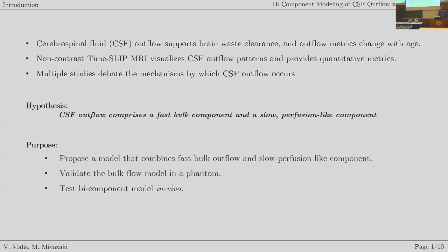So CSF outflow supports brain waste clearance, and outflow metrics change with age. A non-contrast time-SLIP MRI visualizes CSF outflow patterns and provides quantitative metrics. Multiple studies debate, however, the mechanism by which CSF outflow occurs.